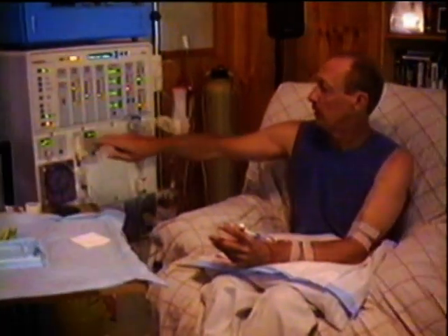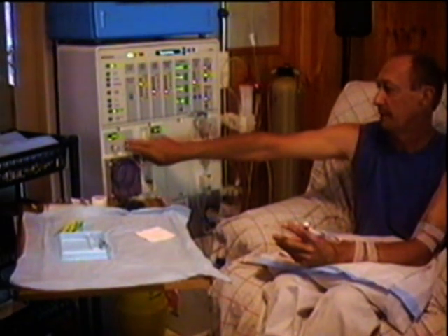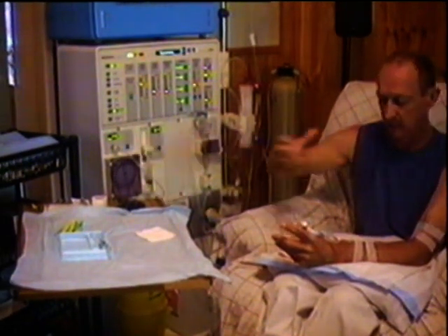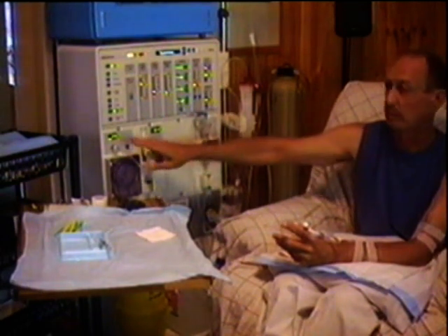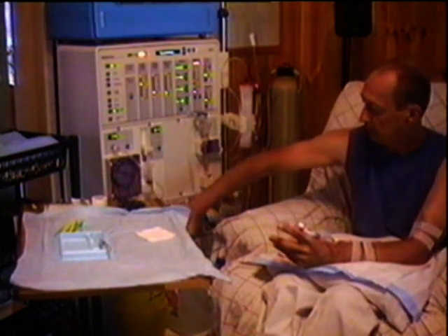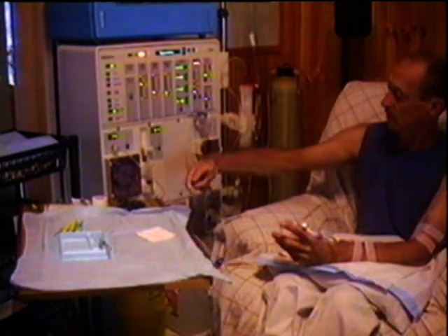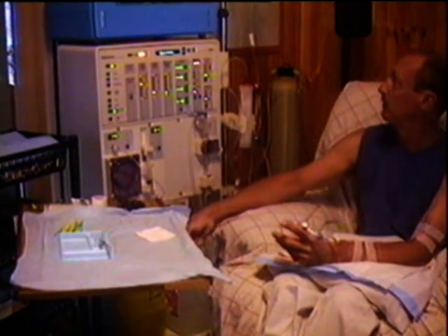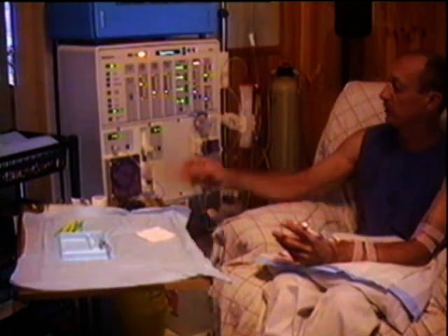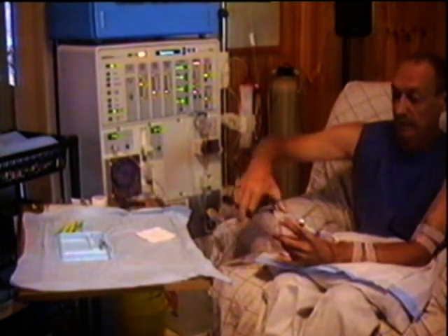I'll turn the flow back on and actually turn the pump rate down to 140. That's what they recommend to start your blood flowing and priming the lines at a speed of 140. We'll turn that off once it's down to 140. Also clamp the line where the saline comes into the bloodline, so we'll clamp the saline off — otherwise that bag up there will flow into your blood, and you don't want that. You only want that if you go flat.